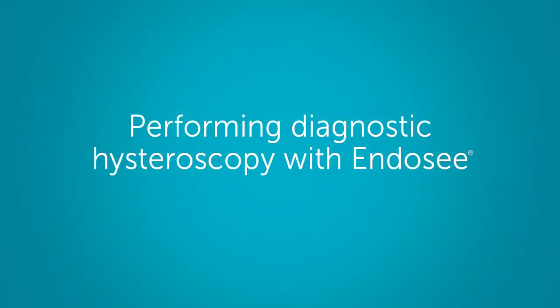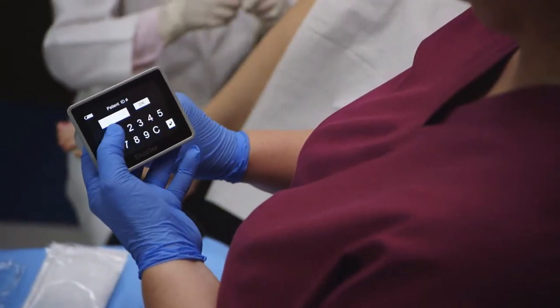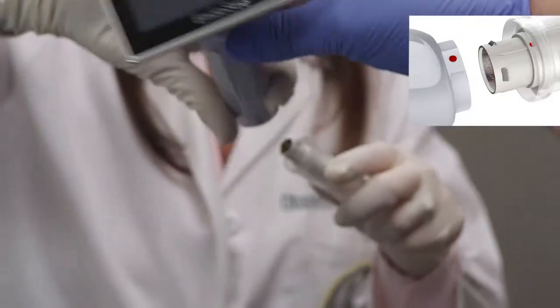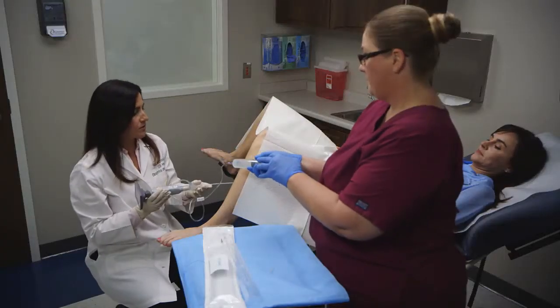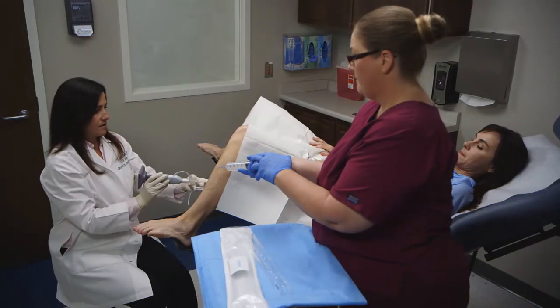You've seen how simple it is to set up for hysteroscopy with Endosee. Now take a look at performing hysteroscopy with this innovative device. To begin, turn on the Endosee handset and enter the patient ID number. Align the red dots to connect the handset to the cannula, then connect the tubing to infuse saline and purge the system of air. Endosee is now fully assembled and ready for use.